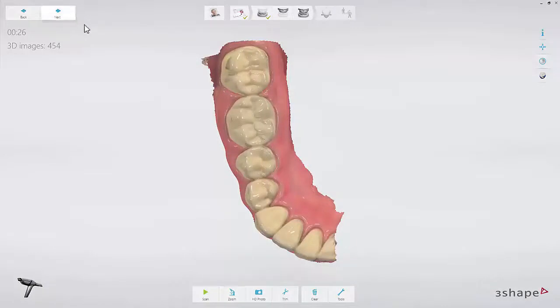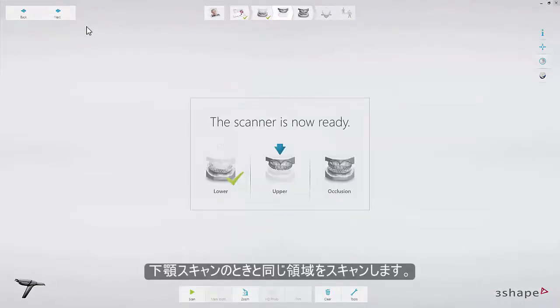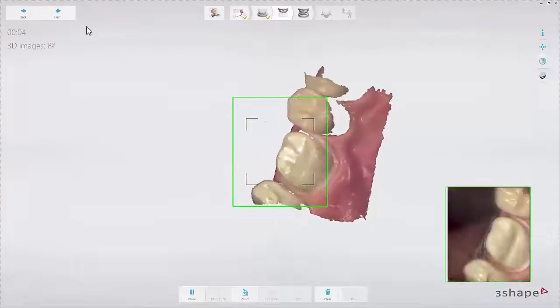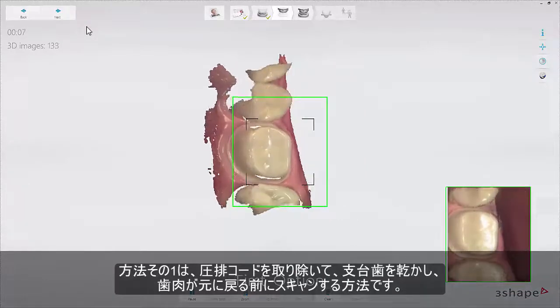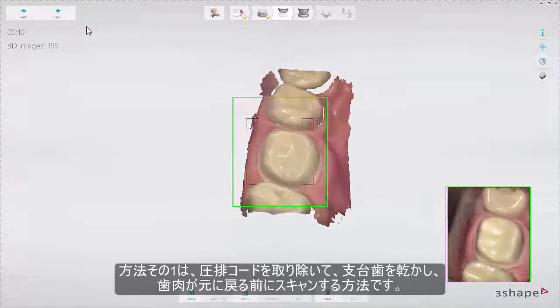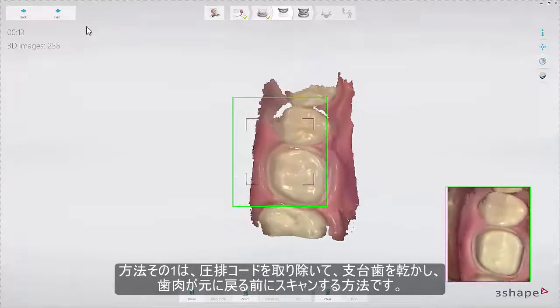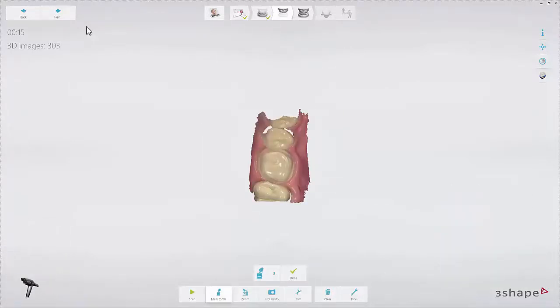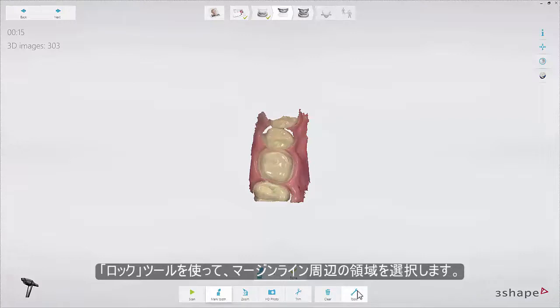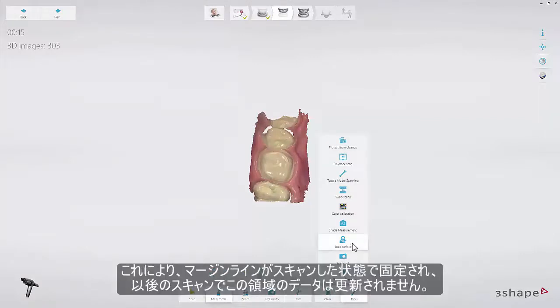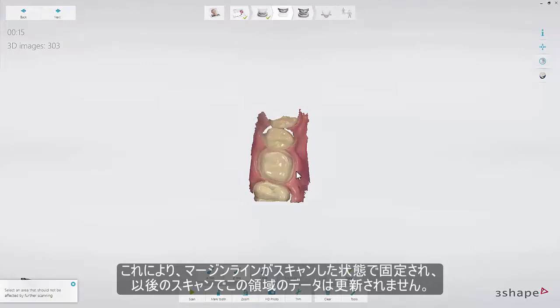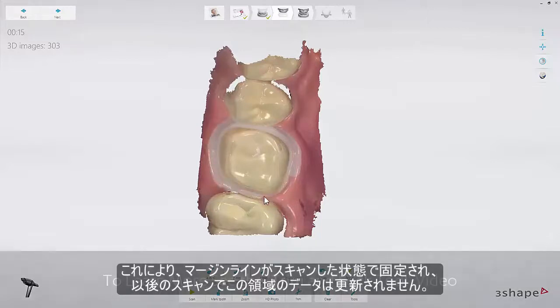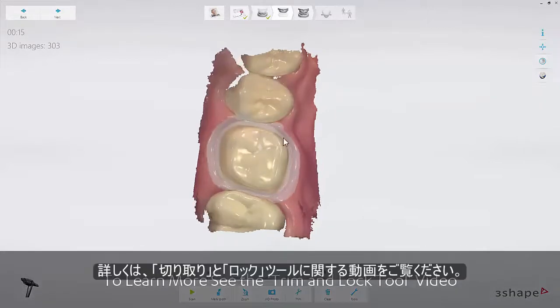Now proceed to the upper arch and scan the same area as in the lower arch. There are two ways to scan an arch with a preparation. The first option is to remove the retraction cord, dry the preparation, and immediately scan the preparation with a clear margin before the gingiva collapses. Make sure to get the margin covered well. Then paint the margin using the lock tool, found under the tools button. This will freeze the margin in its current retracted state, preventing it from being updated with later data when the gingiva might be collapsed. See the trim and lock tool video for further detail.